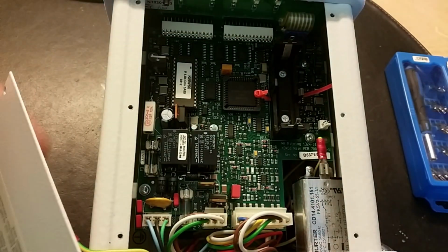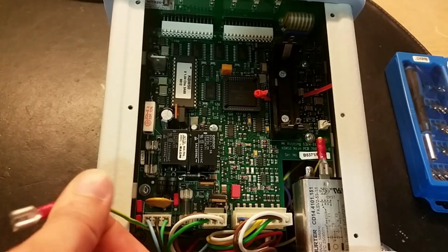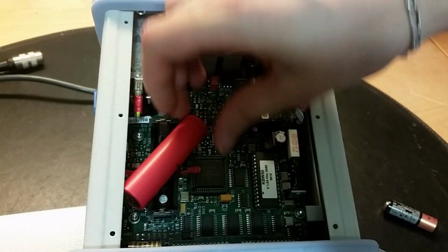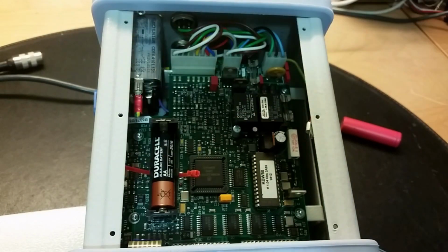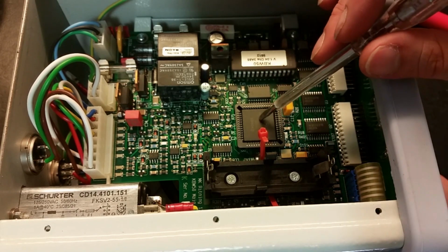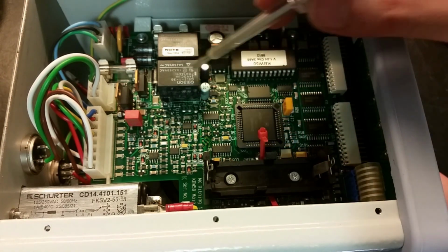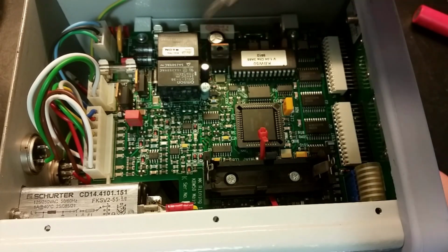This is how it looks inside. There's even an earth tap here. The plate. Let's remove that. The battery holder looks a bit small for 18650. They're not actually fitting there quite good. I think they're actually using just a normal rechargeable AA battery. Here's another view from the circuit board. We got an EEPROM here. We got some logic controller here. We got a bunch of digital chips, 2 relays, some regulators here. We'll have a better close-up on the circuit board later.